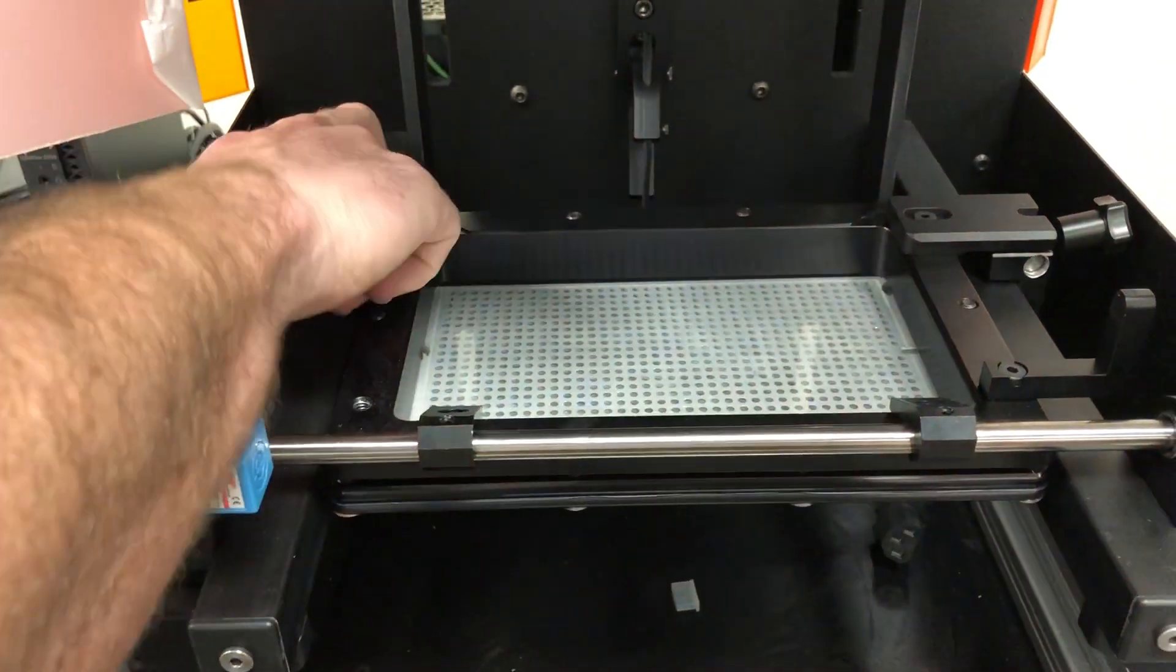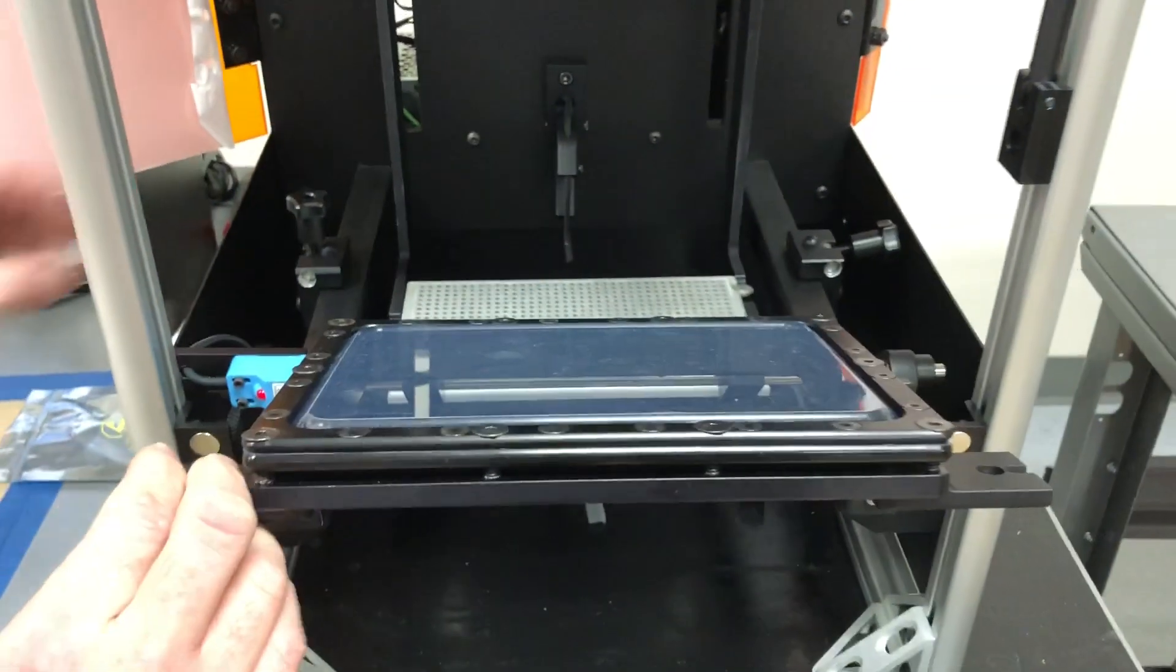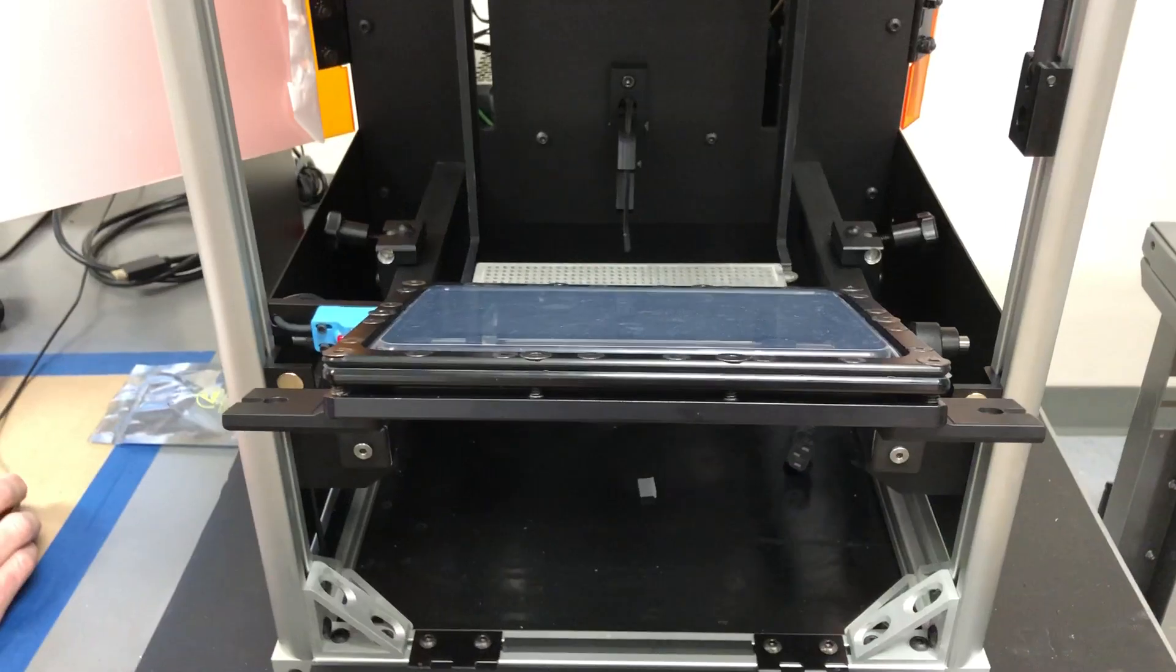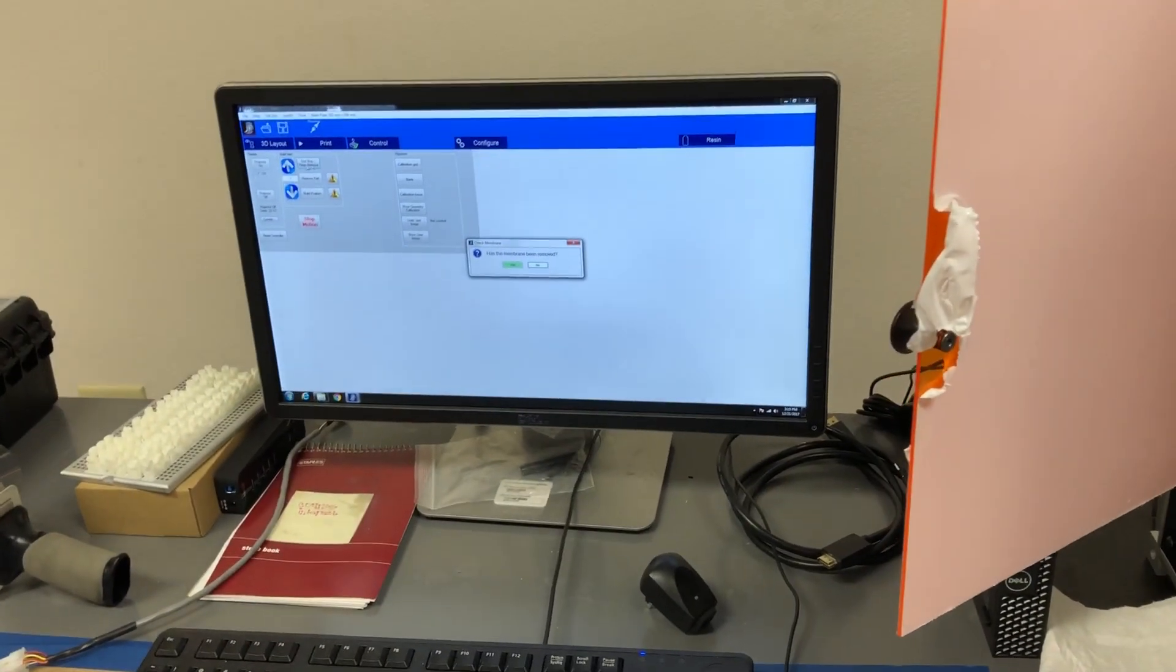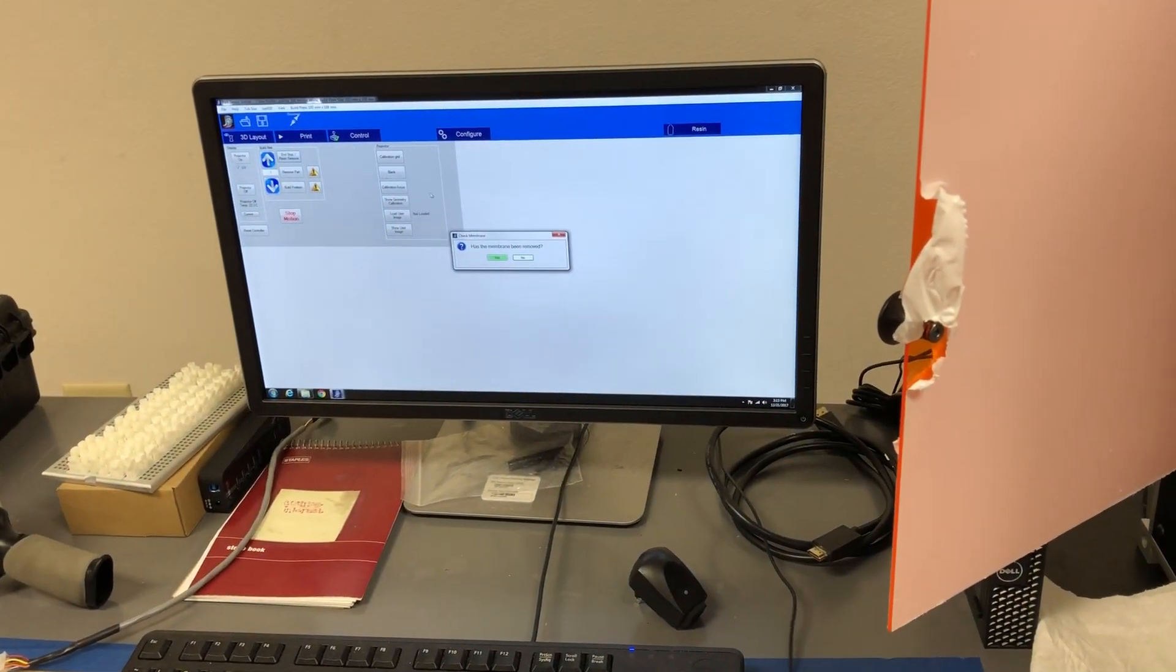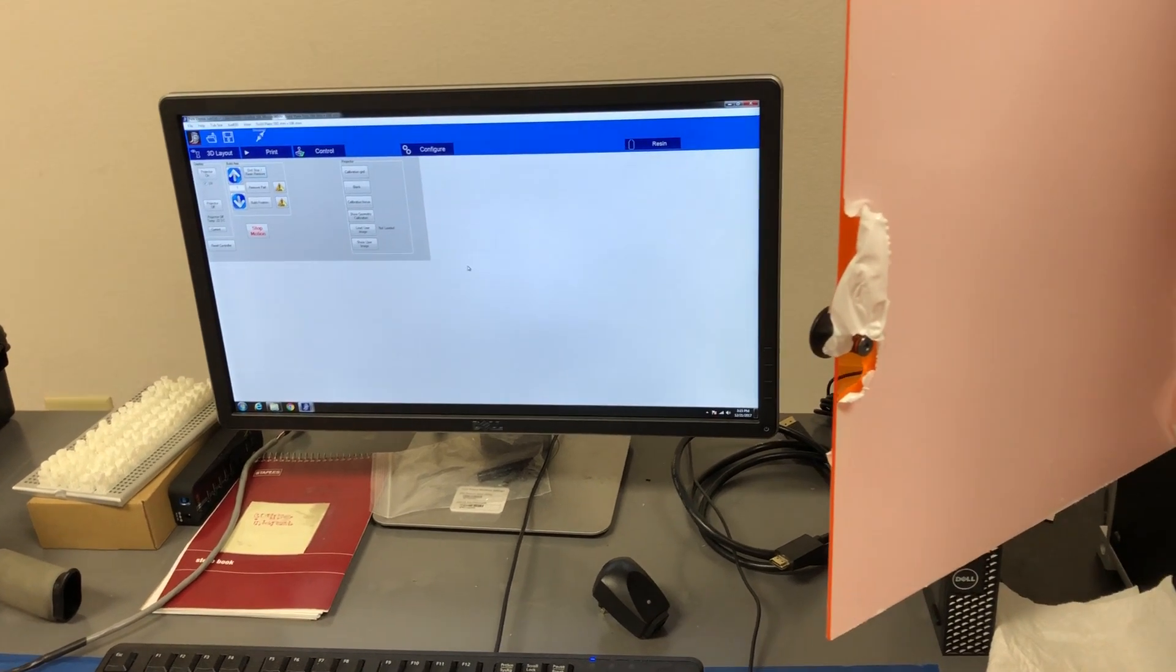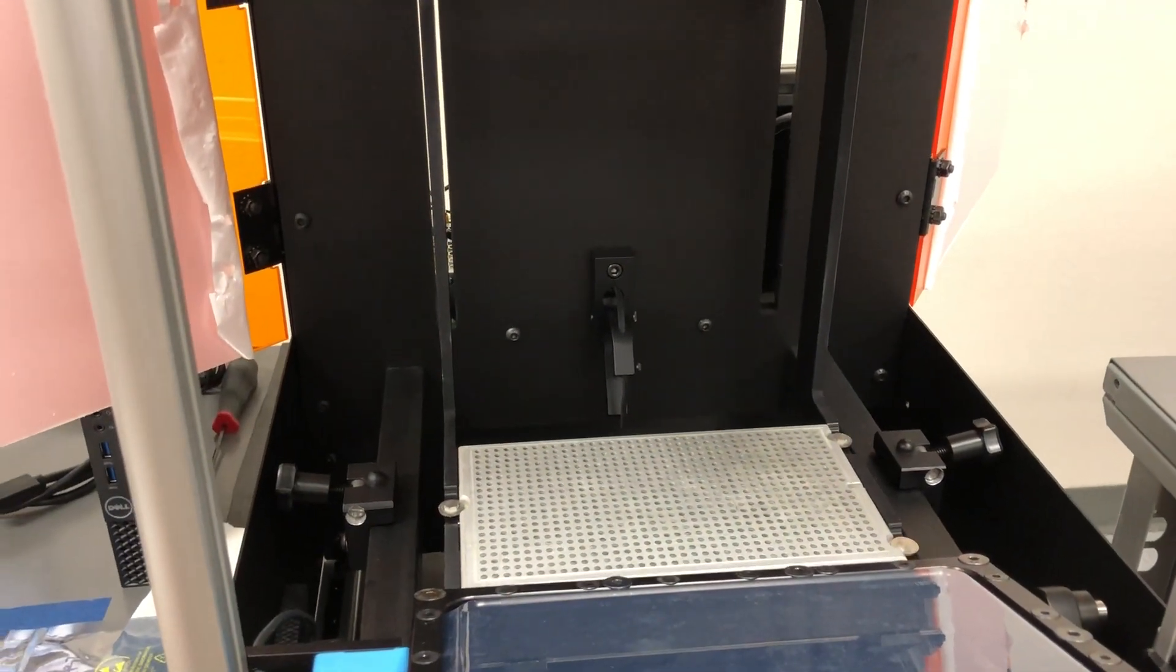To do so, we'll flip the membrane out of the printer, and we will go over to the software and press this end stop resin remove button. We'll say yes, the membrane's out of the way, and here comes the build plate.